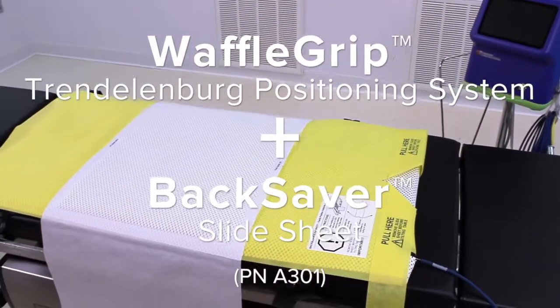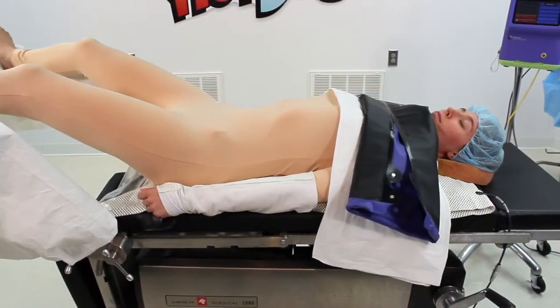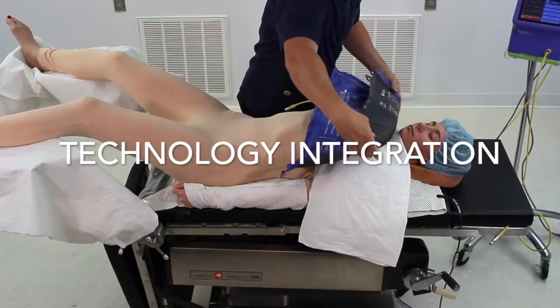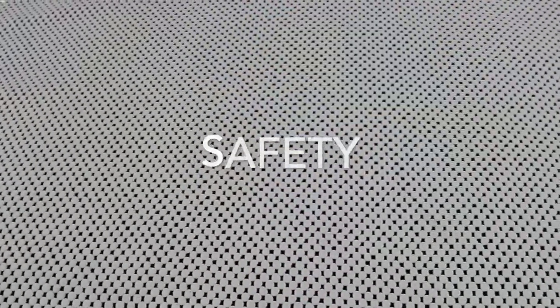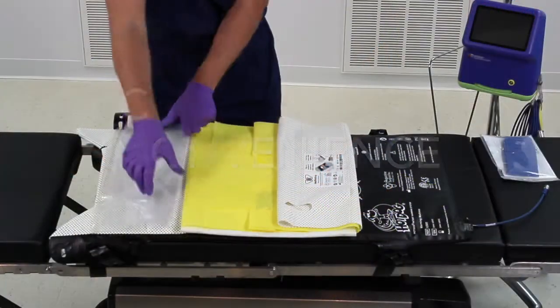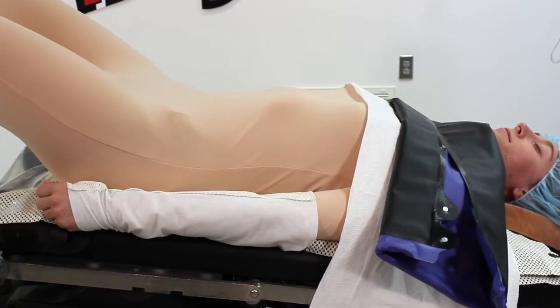Introducing the Waffle Grip Trendelenburg Positioning System plus Backsaver Slide Sheet, part of the Hot Dog patient warming system. This innovative product integrates better warming to help prevent the adverse effects of hypothermia, protection against patient movement with Waffle Grip, efficient and safe patient positioning with the Backsaver Slide Sheet, and basic fluid management with a perineal drape. Here's how to get started.